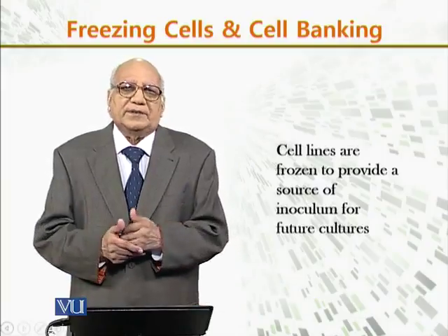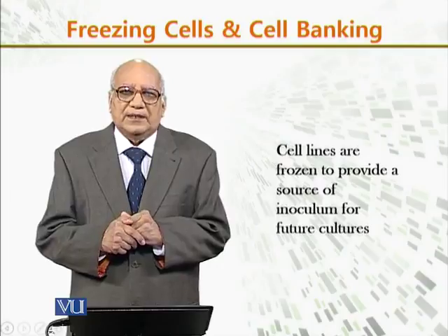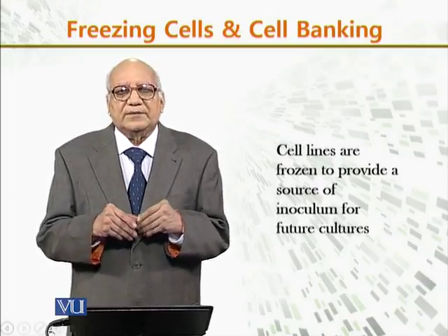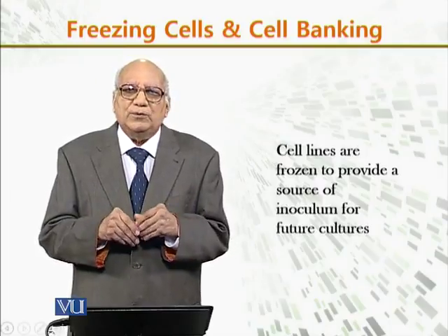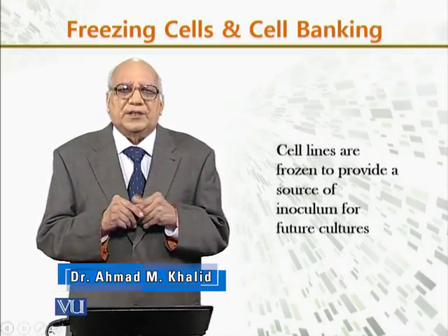Now, cell lines are very important for biologists to work with. And the question is how to keep them for a long time and how to keep them active so that they are available for studies.